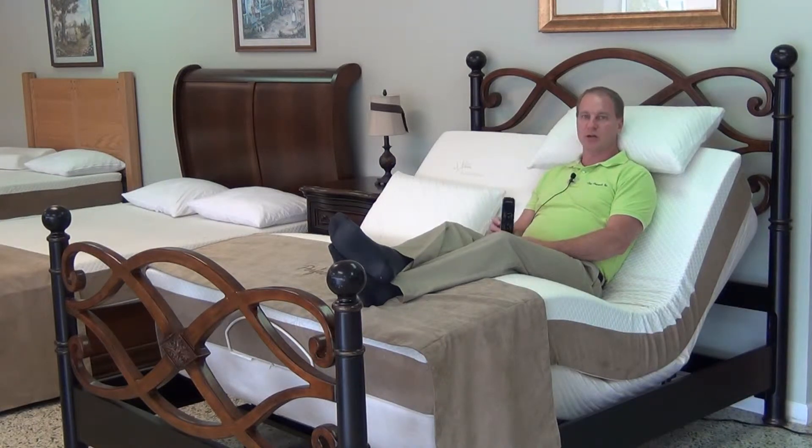Most people, even though they don't want the massage unit, are buying this particular model because they do want the wall hugger feature. Both the ProMotion and this model, the D122, are battery backup. So they do operate if you lose power because it has a battery backup.